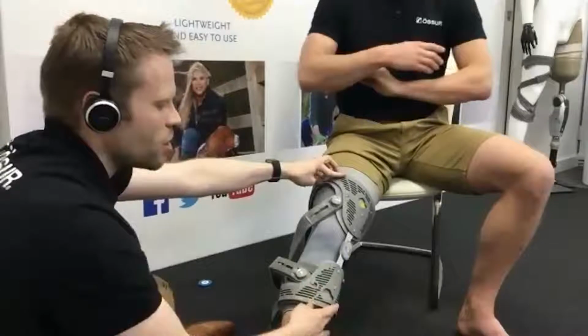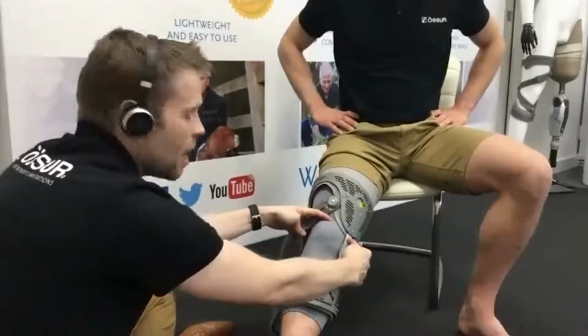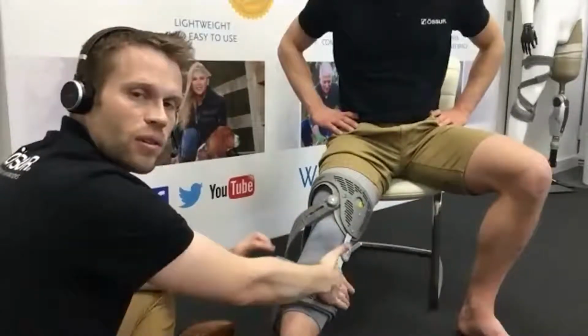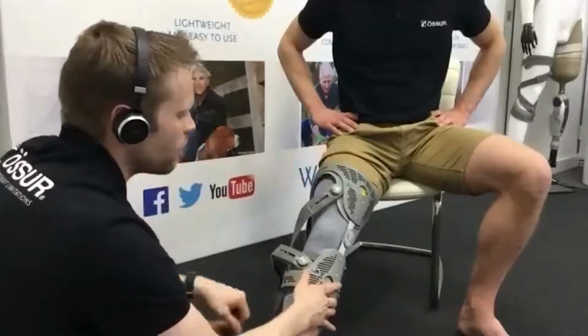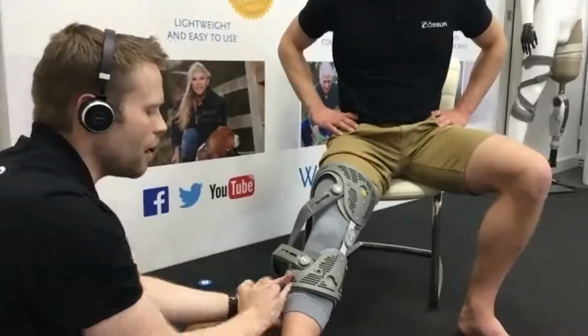So I'm exaggerating, but you can see my hinge position is here, the patella is here. So what happens is as they flex and extend, you will get sort of slight wiggling and surface movement of the frame. So it's really important that we double check we've got that frame in the correct position, correct position AP.